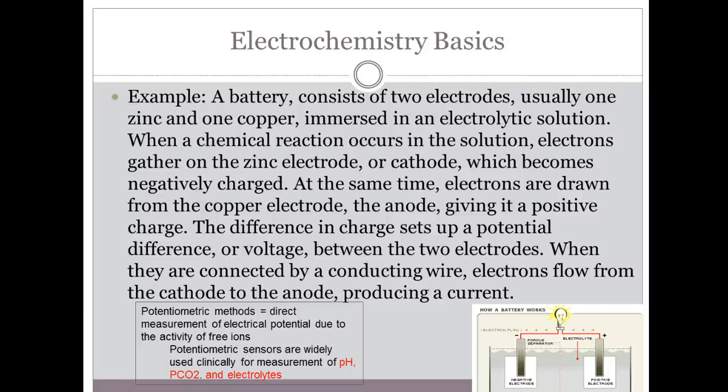But in the laboratory, we use a reference solution and the patient solution and get a potential difference. The potential difference will be able to tell us how much of things, depending on the type of electrode we're using, such as potassium, chloride, and sodium, which are very common ones. Electrolytes are what we use electrochemistry for.